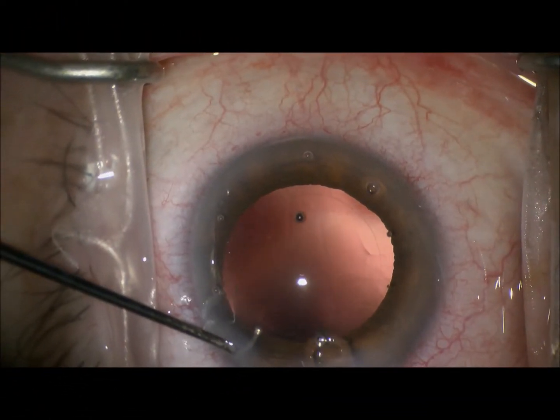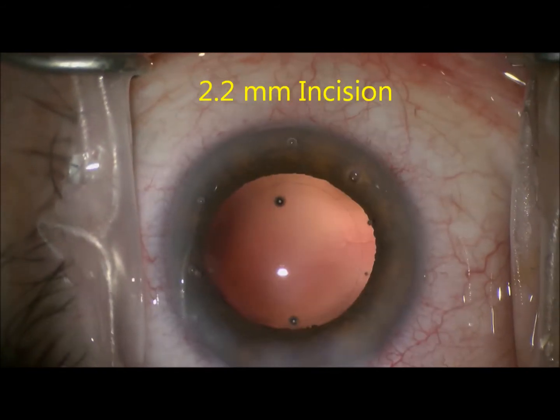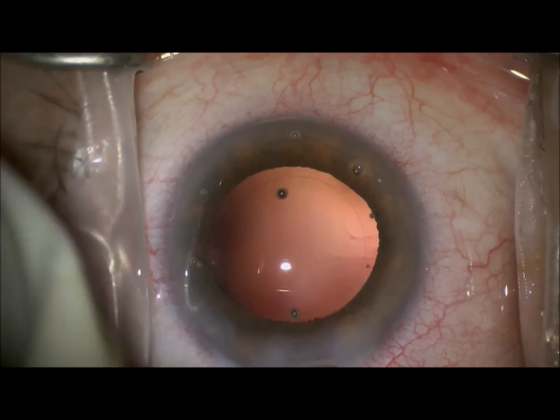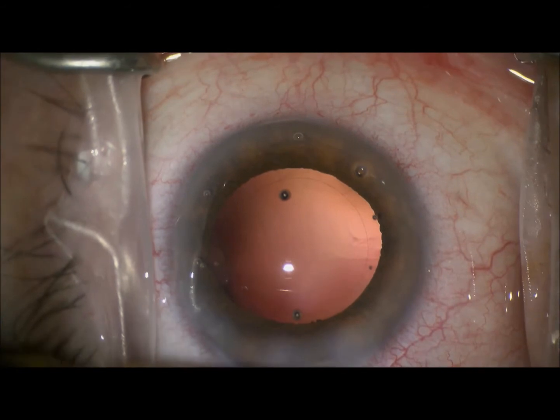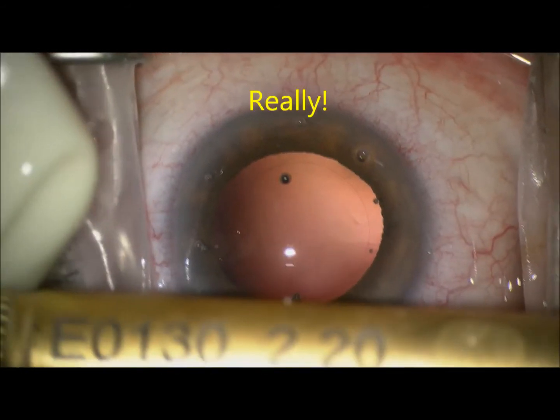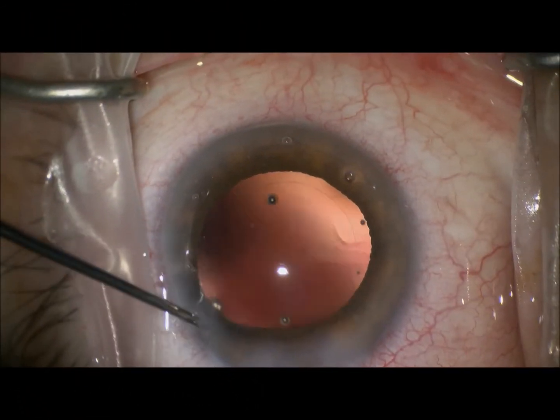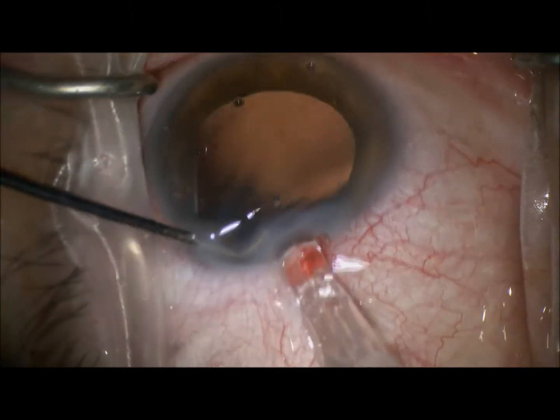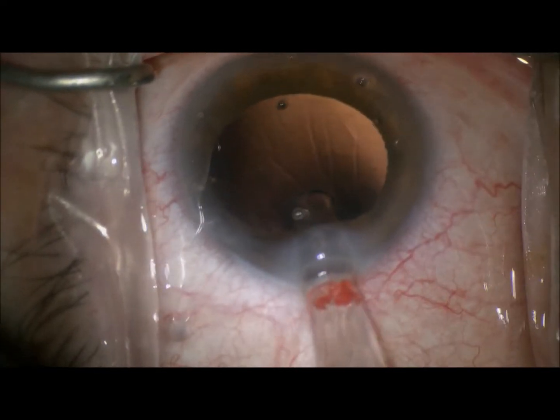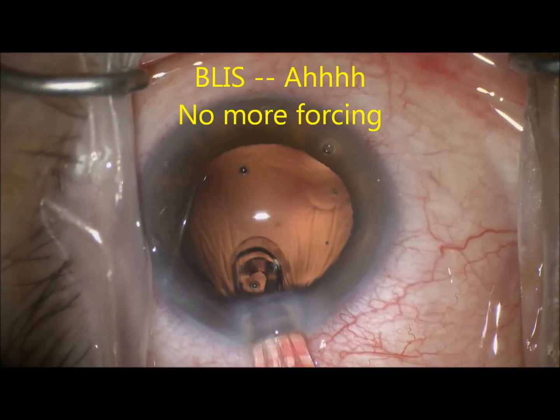After the nucleus and cortical material have been removed, we widen the 1.8 millimeter incision to 2.2 millimeters. And as you can see, it is really 2.2 millimeters, and now the Bliss tip will easily fit through the 2.2 millimeter incision — there's no more of that forcing.